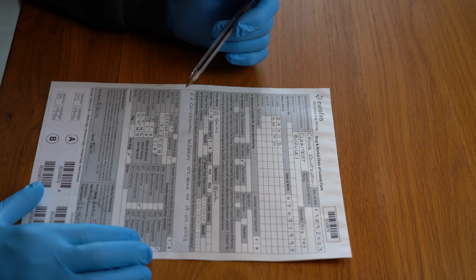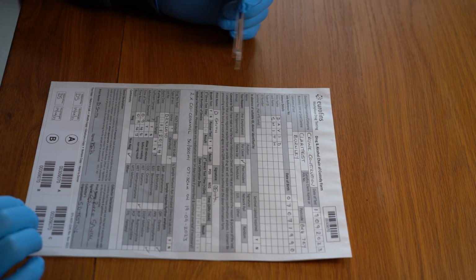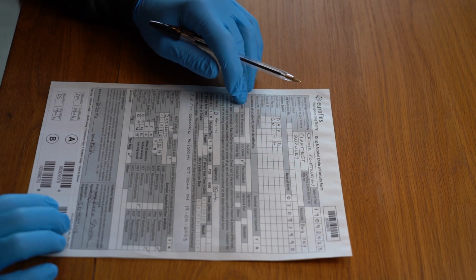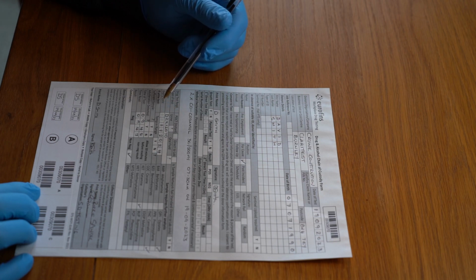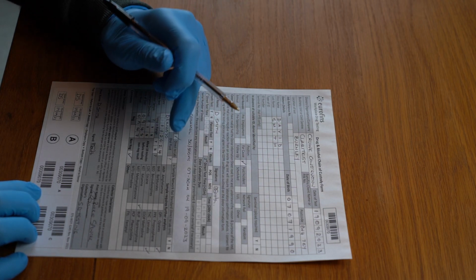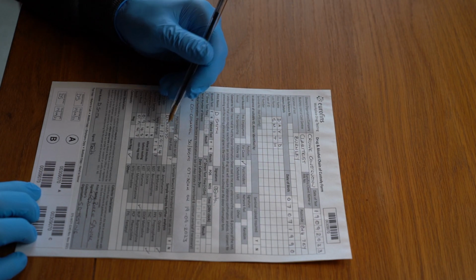All you need now is the medical declaration filled out. And so you're going to need to write down what medication they've taken in the last 14 days. This person had taken 2 cocodamol, 30 over 500mg tablets at 7:30 this morning. So I wrote the details of the medication that he'd taken there. Moving down to the next part here, you do the POC test, so you'll need to tick the box POCT, and you'll need to state whether that test was a urine test or an oral fluid test. In this case, it's a urine test, so you'll need to tick the urine box.